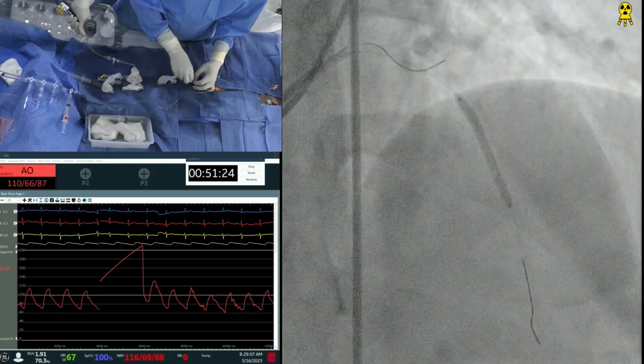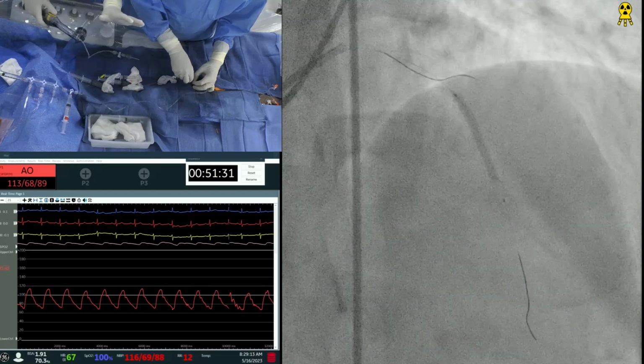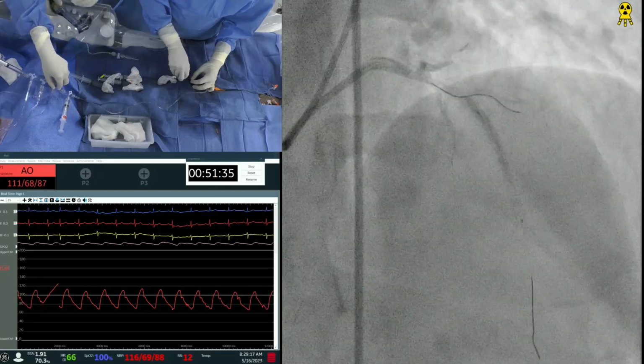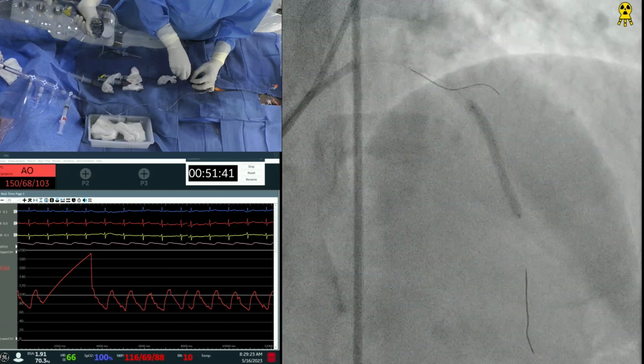No. In proximal diag 16. Yeah, I think it made it. One second. You're in the right place. So the balloon kind of provided you a little anchoring and support there.